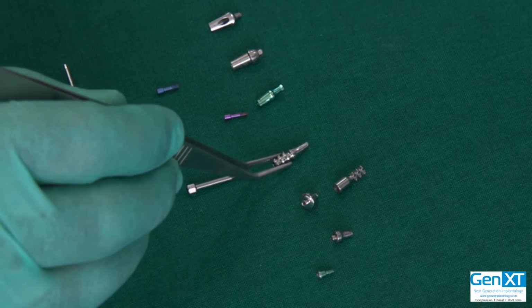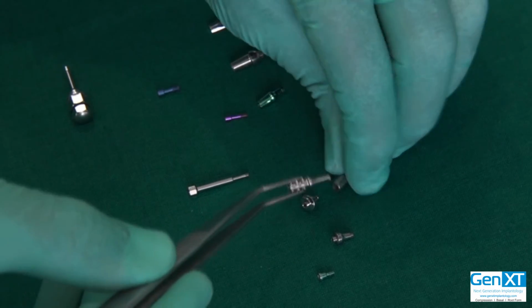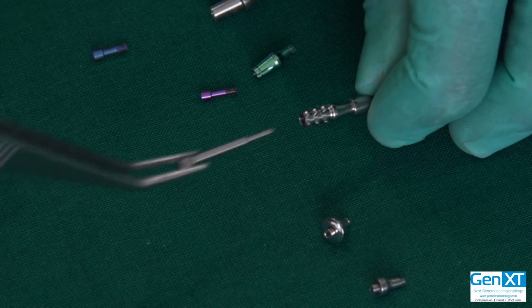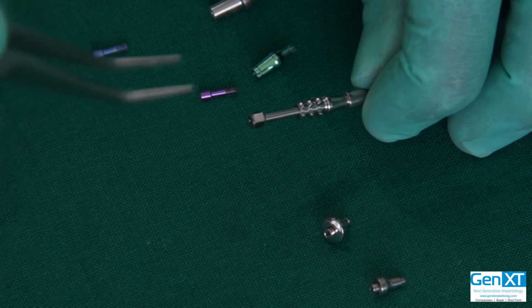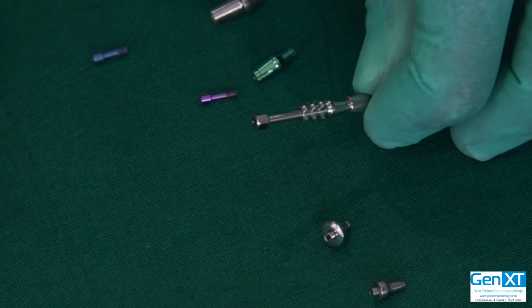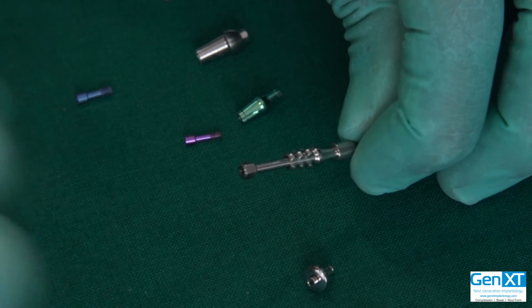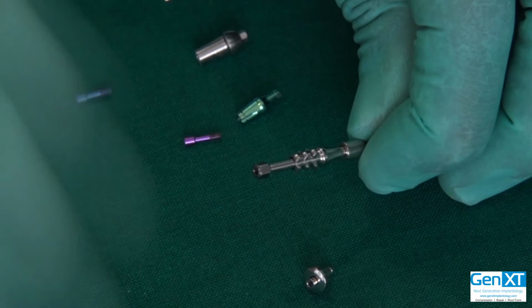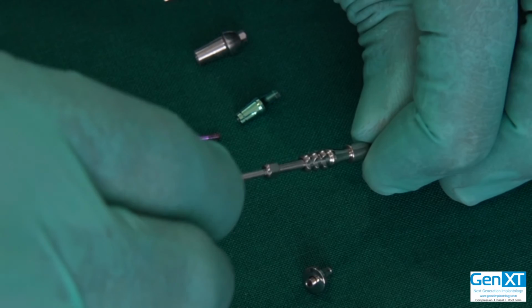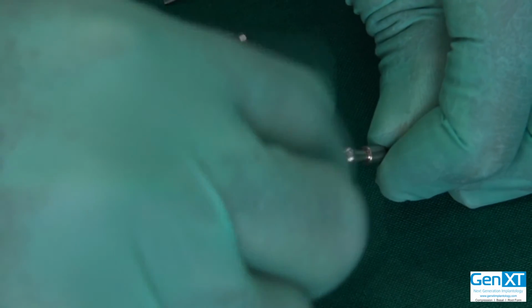Of course, you have your open tray impression post. This is the open tray impression post. You place it into the implant, and you have the option of a long screw. This makes it extremely convenient, as the screw comes pretty high up into the mouth, so there's no chance of it being covered by any impression material. You can screw it in with the hand and take it out with the hand, or you can use the screwdriver, depending on what you like. They have a nice holder on top, so it's very convenient.